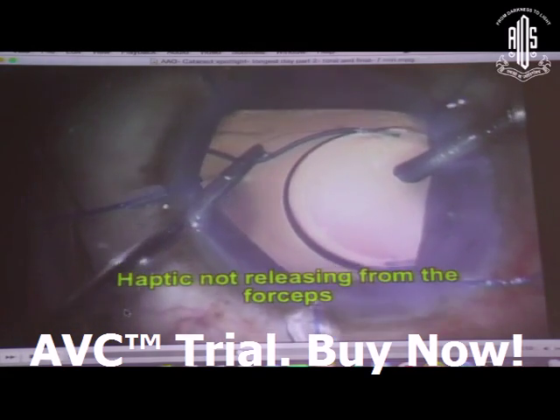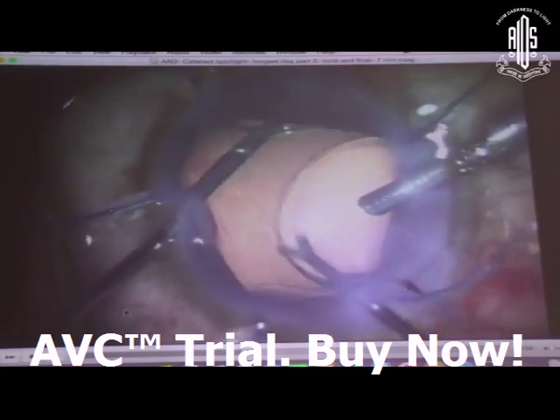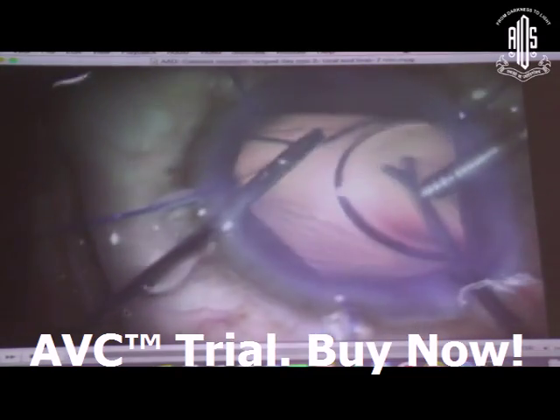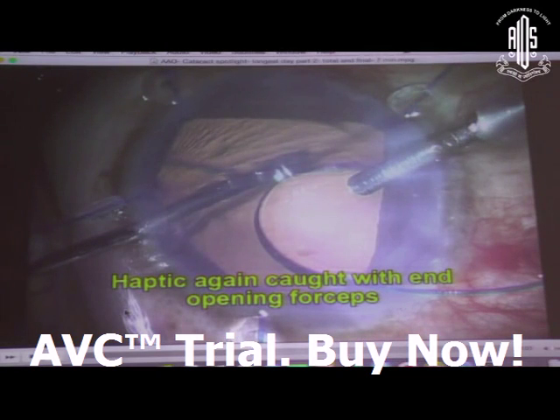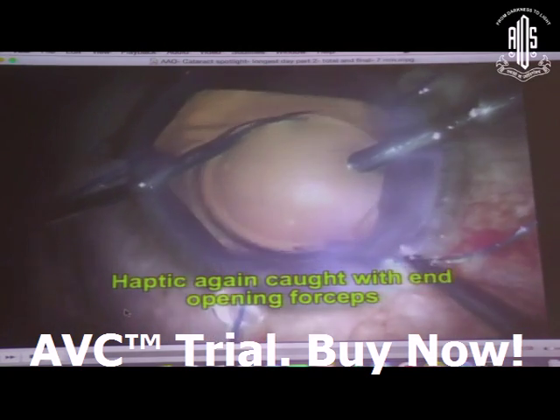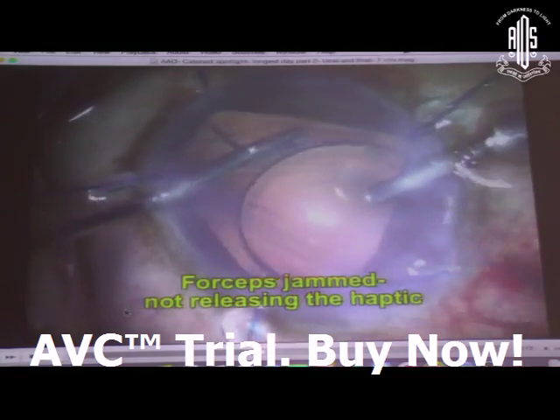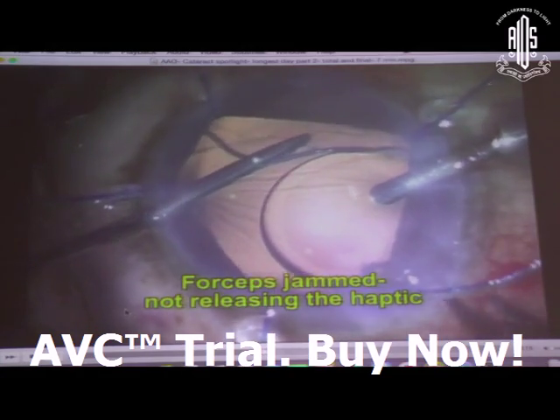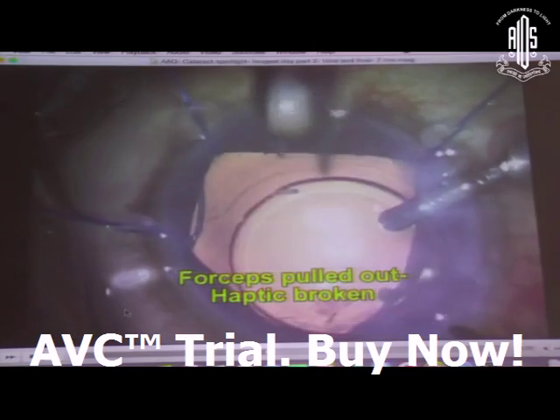When it got jammed, I then decided to try to release it, and to my luck it released suddenly. When it released suddenly, one of the basic mistakes you should do is never use the same forceps again. I used the same forceps again. So you can see from a femtocataract, I've gone into a drop nucleus, gone into a scaffold. Now I'm getting stuck with a forceps which is totally jammed, and second time jamming. Now I'm trying to release it and it broke.